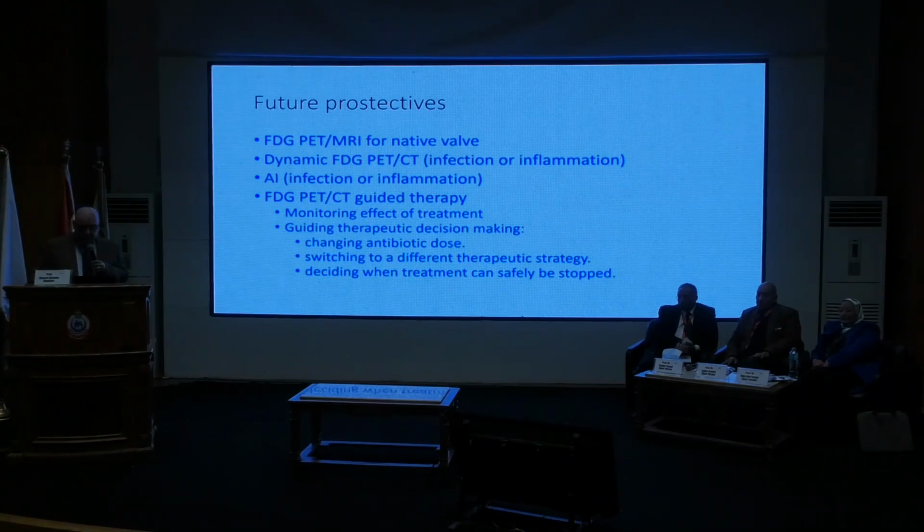Future perspectives regarding infective endocarditis imaging is using PET MRI in native valve, because PET-CT has a low sensitivity in native valve. We can use dynamic PET-CT to differentiate between infection and inflammation. We can use the help of AI to differentiate between infection and inflammation.